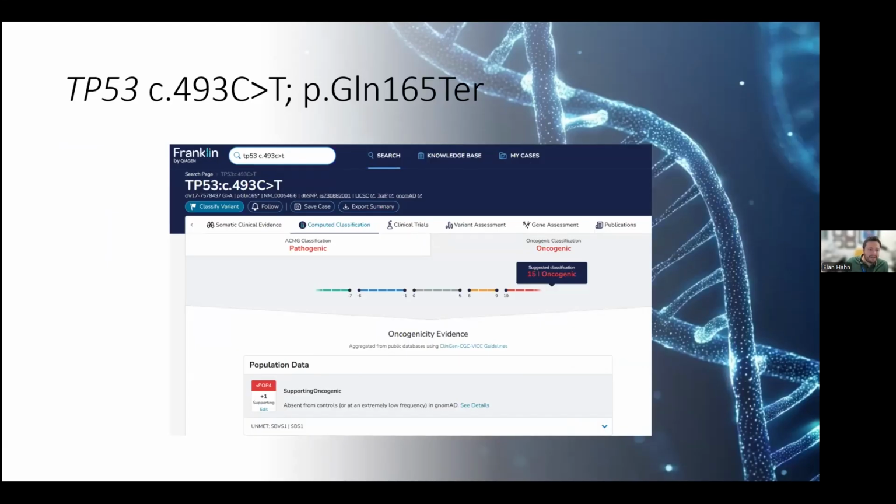And then next, it actually gives you the ACMG germline classification or the oncogenicity classification according to what it can pull from publicly or automatically. So it's not a thorough evaluation of every one of those metrics, but it's what it's able to pull. So it may not be able to pull evidence for other metrics that you could find.